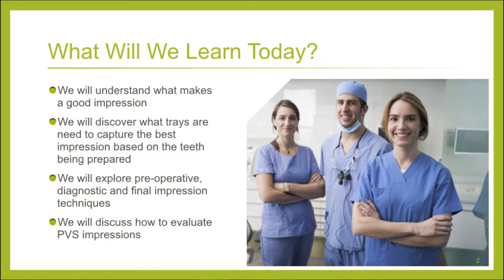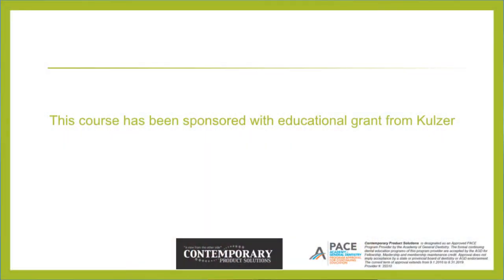And then the last part is probably my favorite and the most important: how do we look at these areas that are bad in impression. As a team member, we sometimes are not made aware of the mistakes that we've made, and also even for the doctor taking a final impression. So we want to make sure that you understand how it happened and what we can do to correct that in the future.